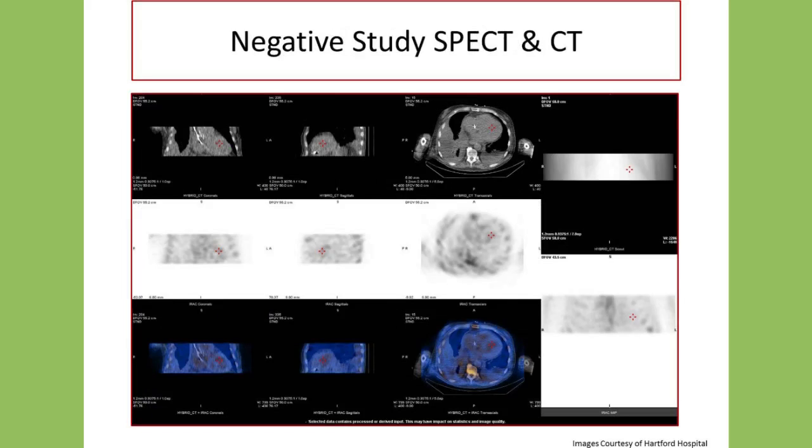And when we look at the SPECT study, in addition to SPECT being important, there is a thought that performing these with SPECT/CT, to have the CT used as anatomical markers, helps with the identification of location for myocardial activity, and also helps differentiate between myocardial blood pooling and myocardial uptake, as I'll show in a minute.